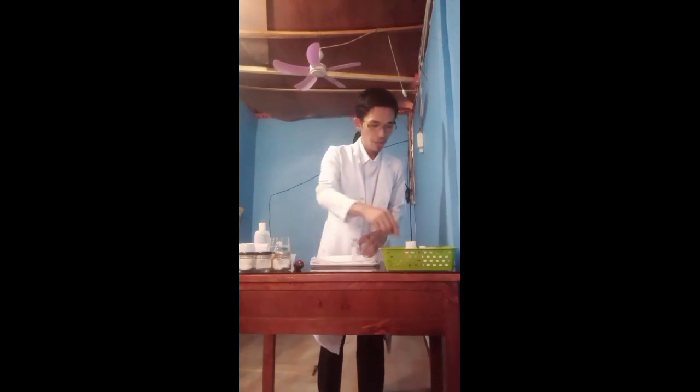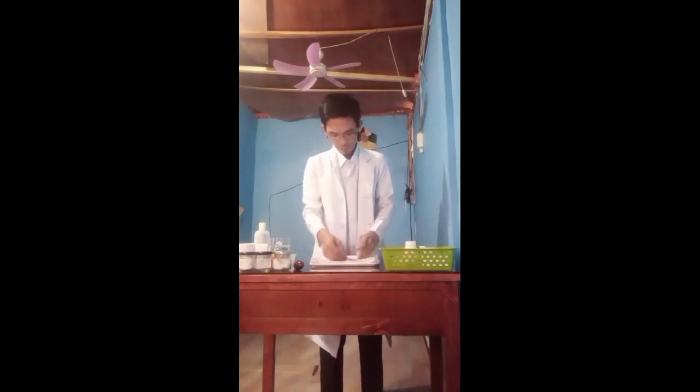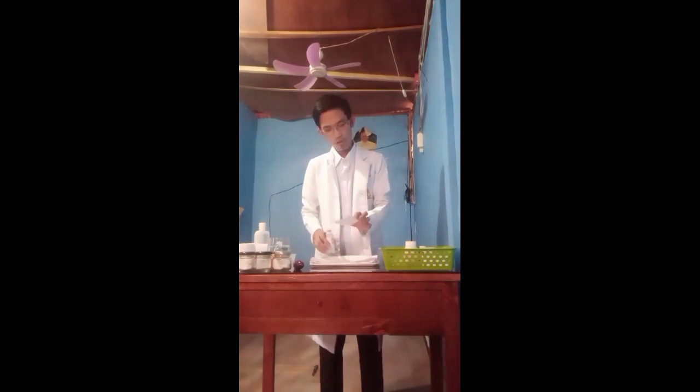After removing the cup covering the vial, you need to pick up the syringe and remove the needle cap. Then pull back on the plunger. The sterile water for injection is 1 ml. I have here the medicine ticket, just to remind us that it is correct.